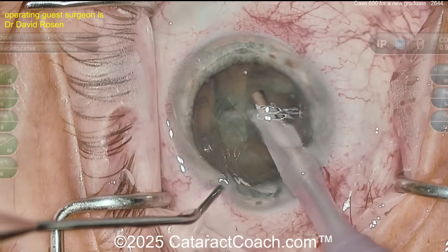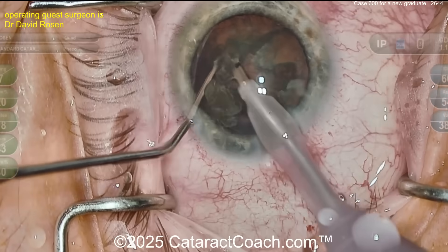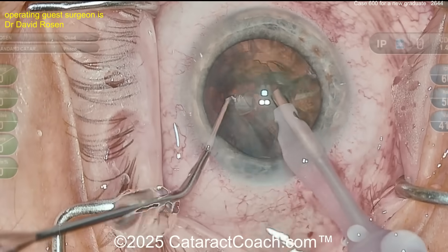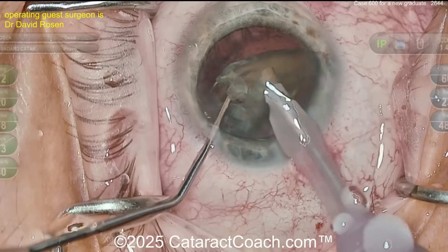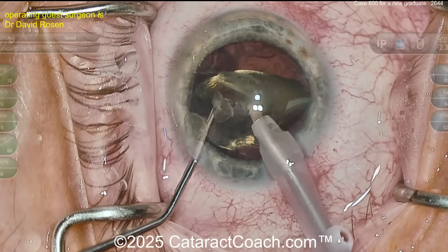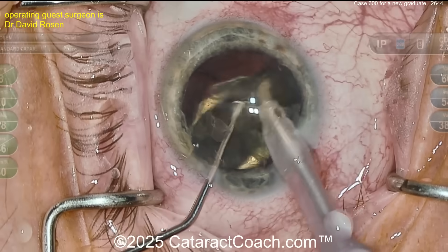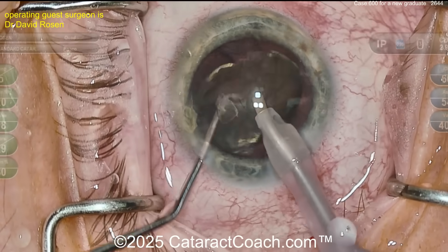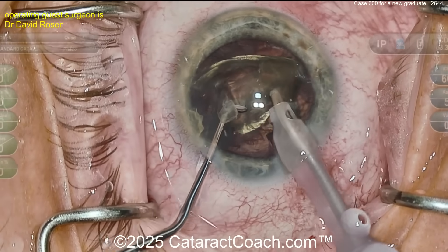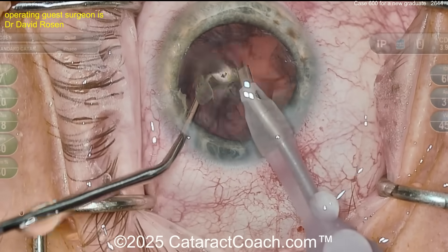Maybe propagate that crack a little bit more, or just tilt the whole thing up again — it's not very dense. A helpful hint: make sure you really separate the two halves when you get that first chop in; propagate that chop all the way through. Look at that — beautiful, coming out nice and easy. At this time probably have your technician loading up the lens. Slight movement of the phaco tip will change fluid currents and bring all the pieces to the tip. Looks like a purple sleeve — maybe that's a 2.75. Aspirate, aspirate, aspirate — those come down pretty easily. Very nicely done. Case 600 is a good benchmark.